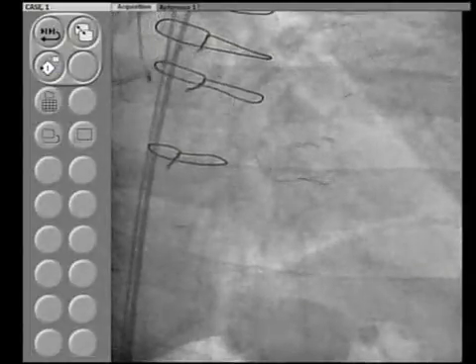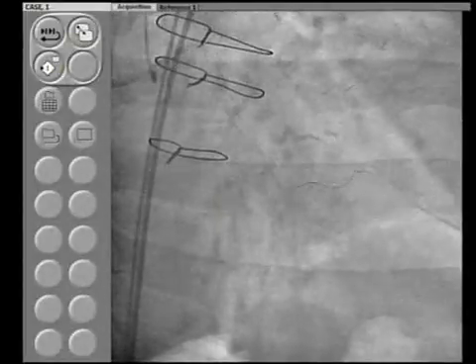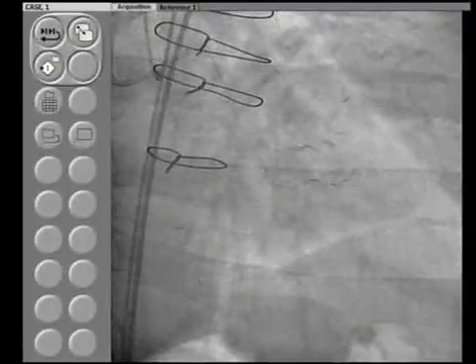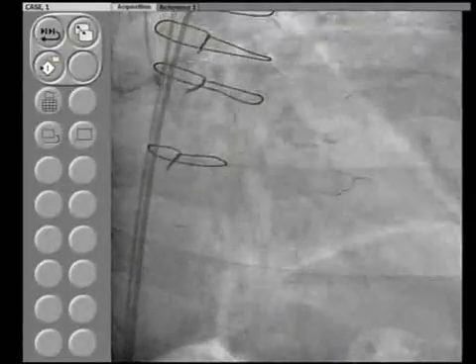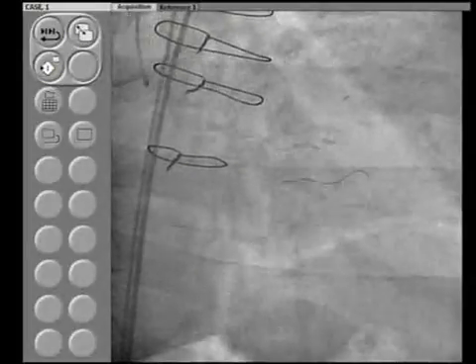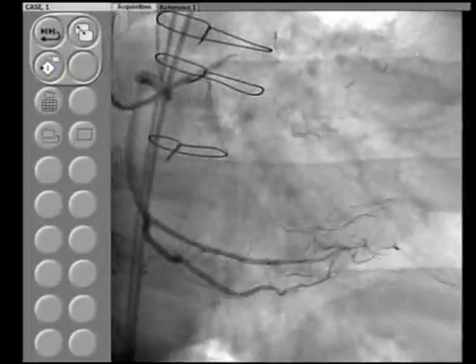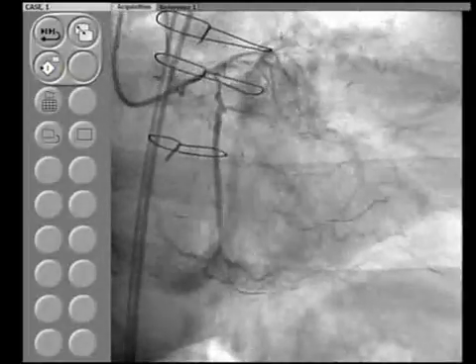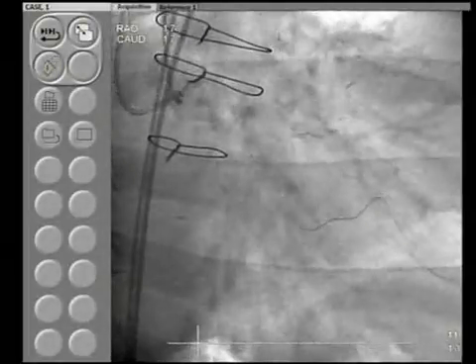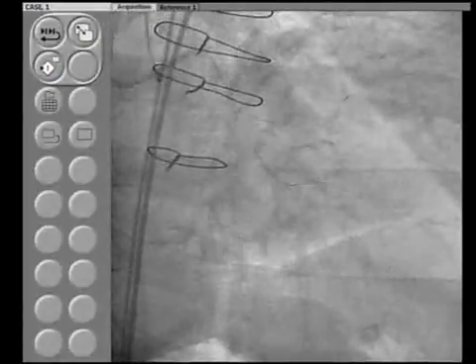Okay now. Is it in the lumen? Okay. Let's see. Pull back the catheter a little bit. No. Okay, we are giving a contralateral injection. You will do it a little. Go in cine. Not yet. I'll tell you. When you do a contralateral injection first, and then antegrade later. No. Very hard to make out in that view. No. Let's study that a little bit. Now, right now is the decreased flow part of that?